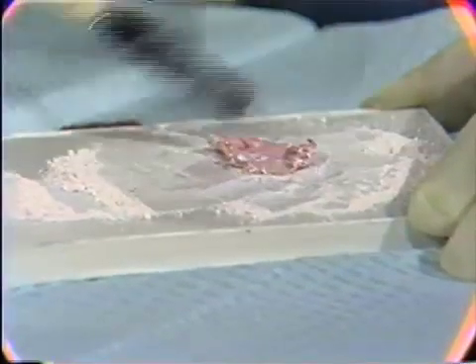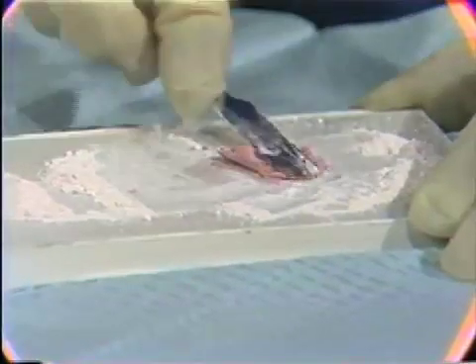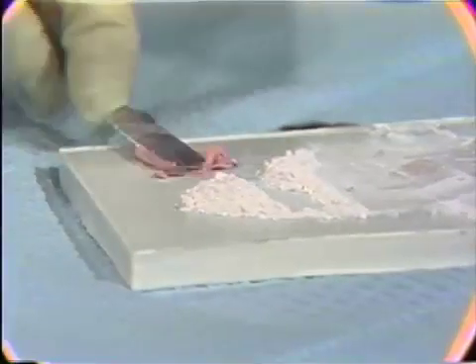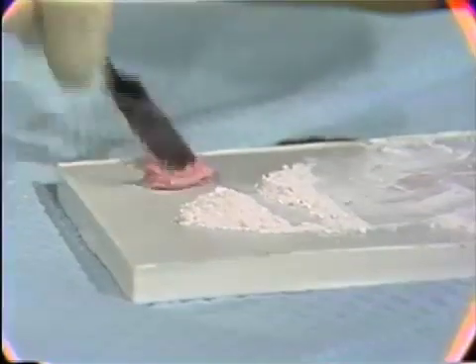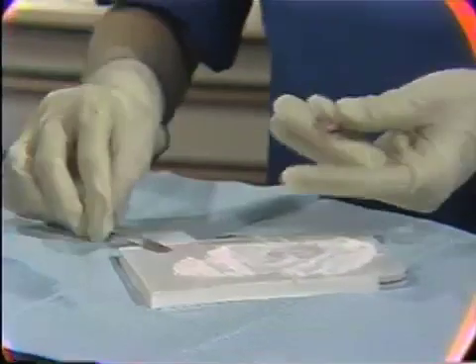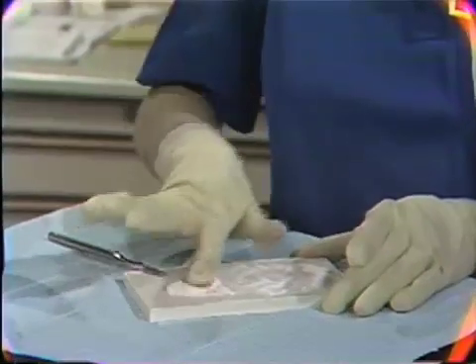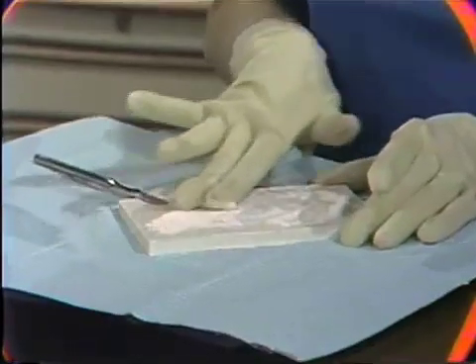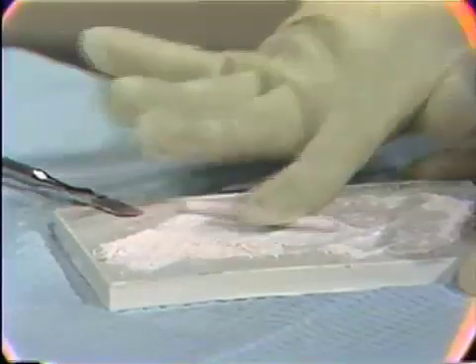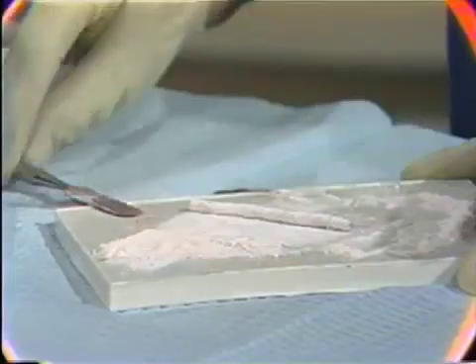When initially using a dressing material like Ward-Wonderpac, one of the big problems with placing it intraorally and pressing it around and between the teeth next to the gingival tissue is that when you pull your finger away, it will stick to your finger rather than stay in the patient's mouth. This is where having the dressing material very thick is important, and the next most important item is to have it well rolled out with a lot of powder incorporated in the surface. Notice how Darlene balled that up and is now rolling it into a rope approximately one quarter the size of a pencil, continuing to roll it in the powder uniformly. The dressing material will be cut in the middle.